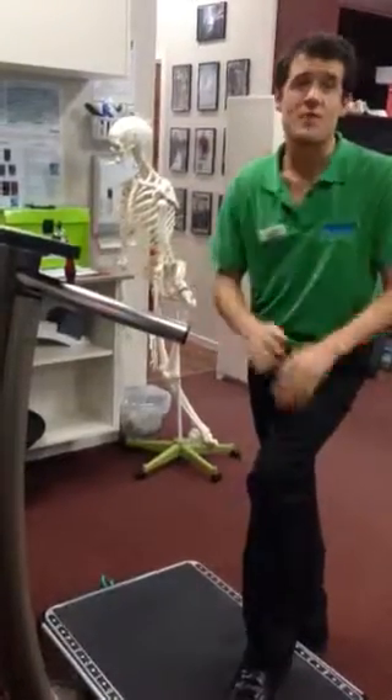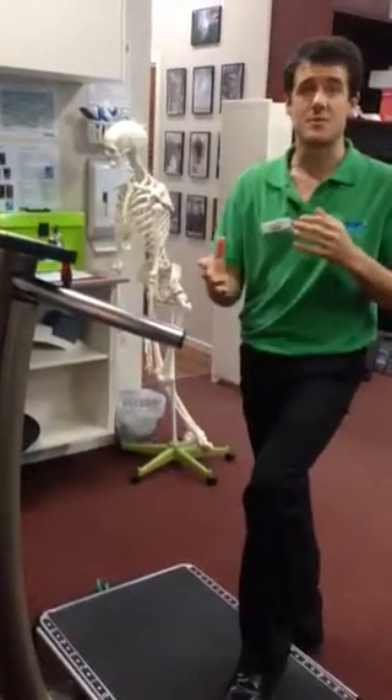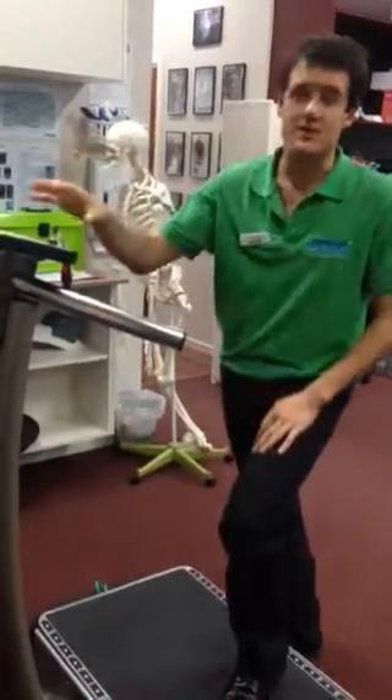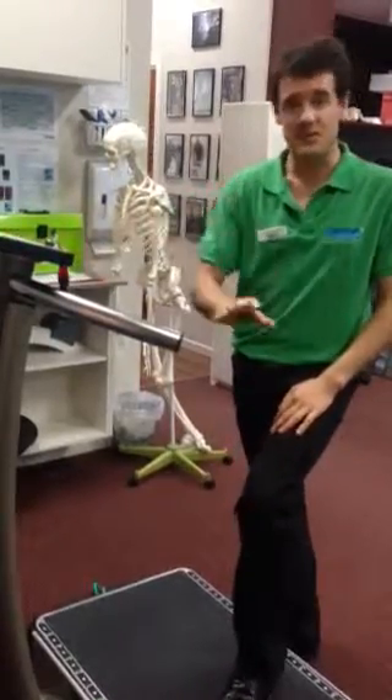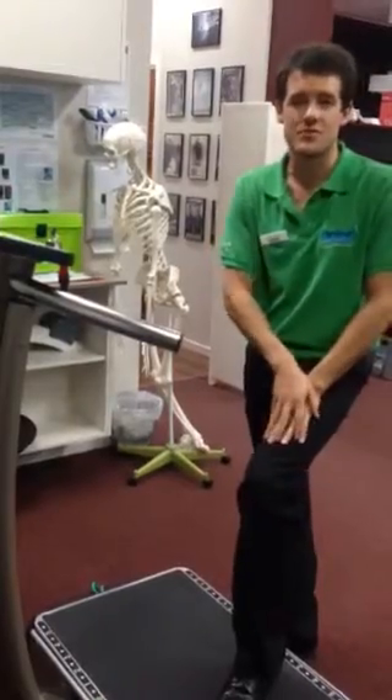I'll just give you a little demo of how the machine works. And if you have Achilles tendinopathy, we'd love to see you in for an assessment. This could be a really great tool to help you get better as fast as possible, getting pain-free so that you can get back to doing the things that you love to do.